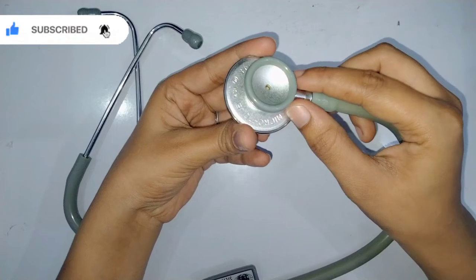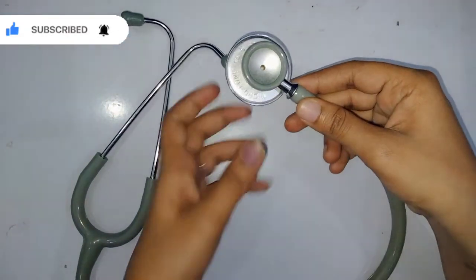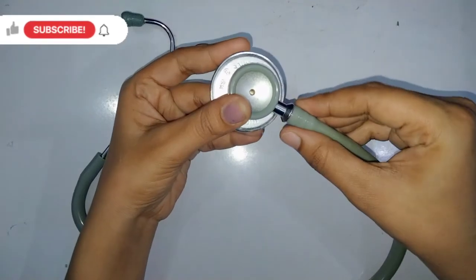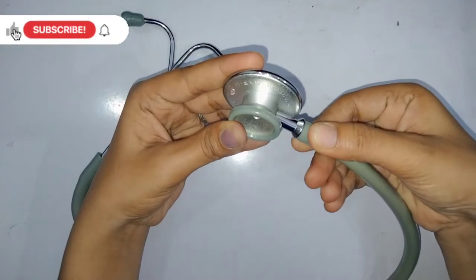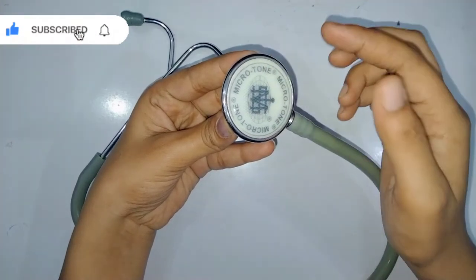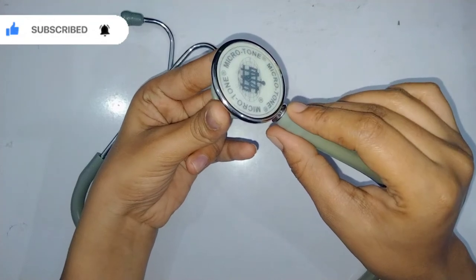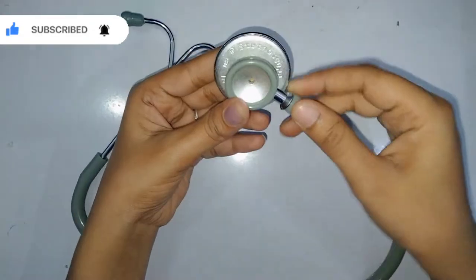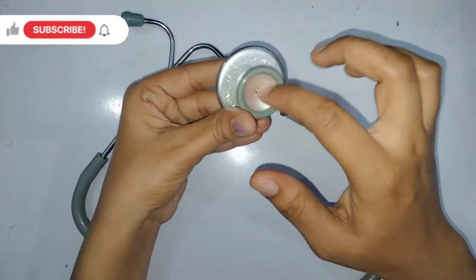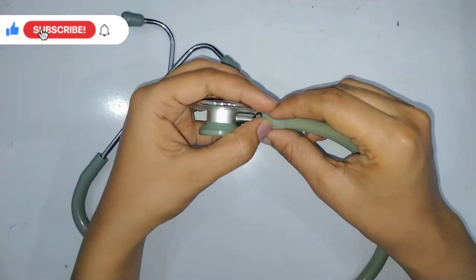The stem acts like a switch — on and off. When we turn it on, we can hear the high frequency through the diaphragm. When we turn it off, we don't get any of that sound — only the low frequency can be detected by the bell. So this was all about the chest piece.